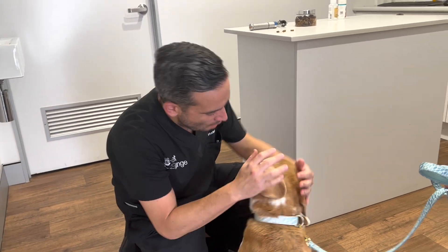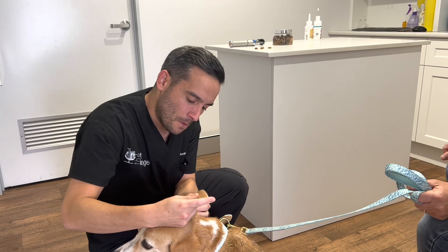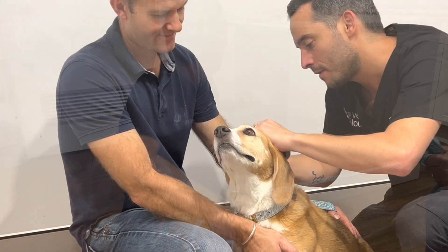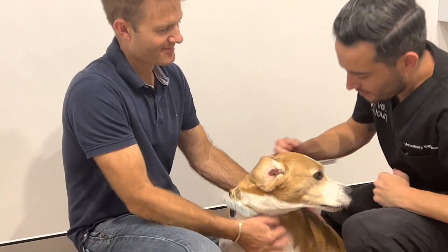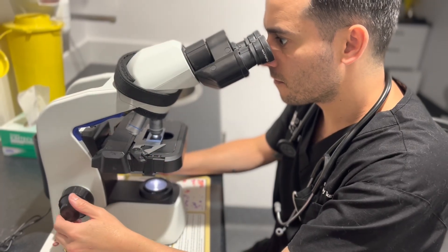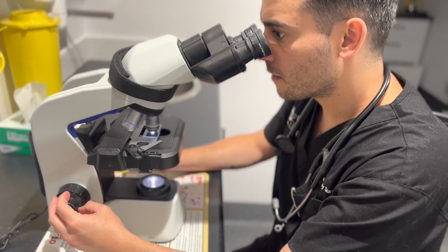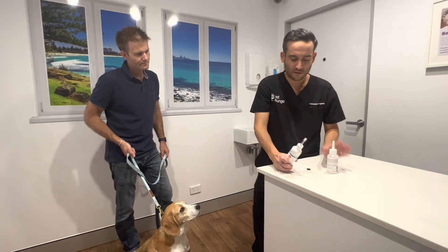We may need to extend or even change the treatment depending on how your pet is responding. During this exam we will once again take a sample from the ear and look at it under the microscope. If the test shows that no further treatment is required, we will discuss with you a maintenance program to minimise reoccurrence in the future.